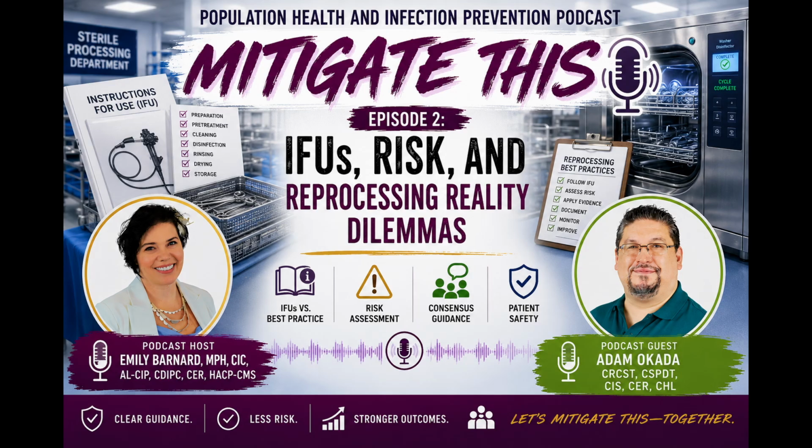But I think the MAUDE database is such an important way of really looking at how some of these different devices can also be manipulated, such as when you have instructions for use for a specific instrument, but it doesn't quite meet the physician's needs. Have you ever seen some instruments that may have been melted or customized, changing the metallurgy to create the device that they're looking for, not the device that they have?